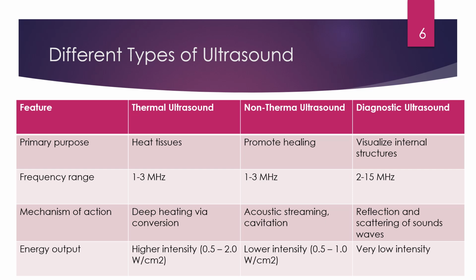It does not provide imaging for us to look at, but instead, what's happening is mechanical waves are converted into heat, or they create effects like tissue healing through cavitation. So those are some things that we're going to be discussing as far as our lecture goes today for therapeutic ultrasound. Whenever we are talking about diagnostic ultrasound, the ones that produce images, these ones typically use higher frequencies, up to about 15 megahertz or possibly more.